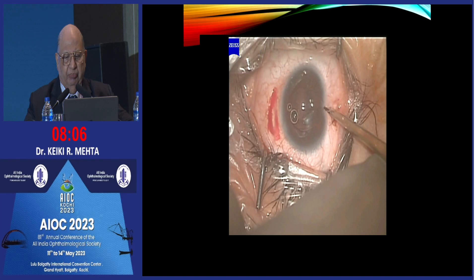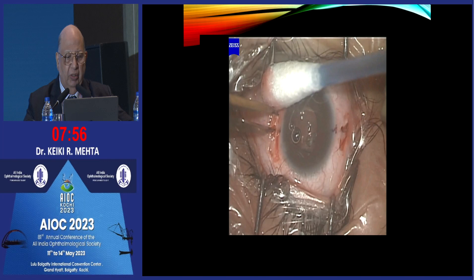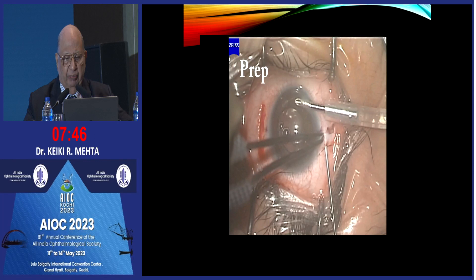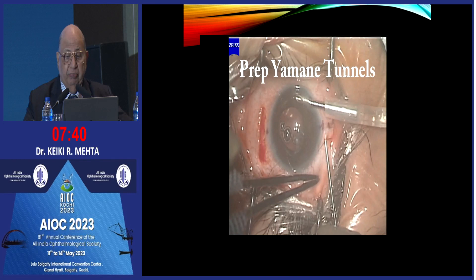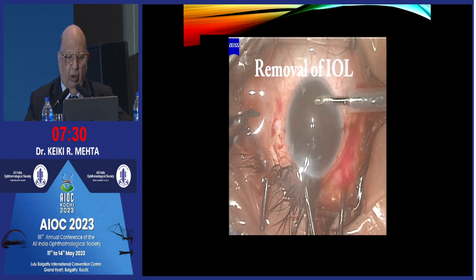Now mark using your squint marker, set it to three millimeters — just one and a half millimeters on both sides. This gives you a zone through which you will be able to insert your sutures horizontally and vertically from the opposite side. The vertical points are from where I am going to enter subsequently. I always prefer to use a maintainer to keep the chamber stable. Now here you prepare the Yamane tunnels using a needle, making two tunnels down the line.